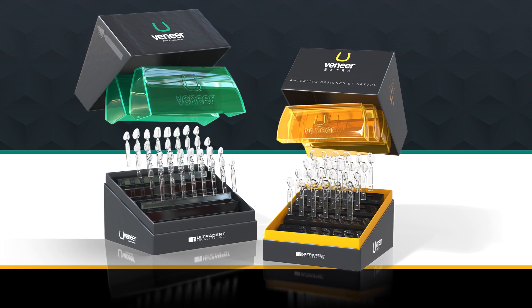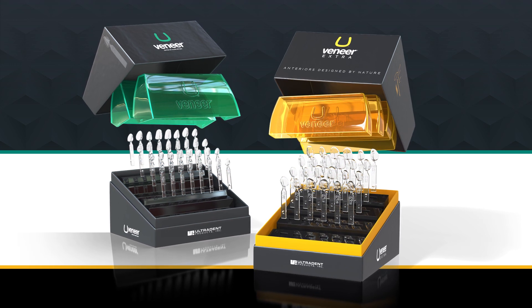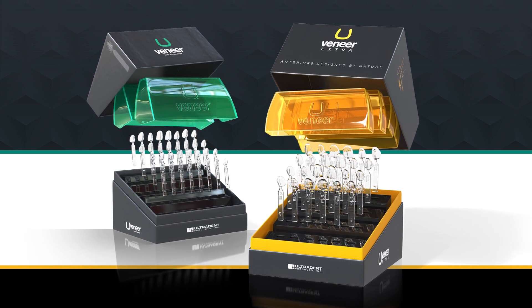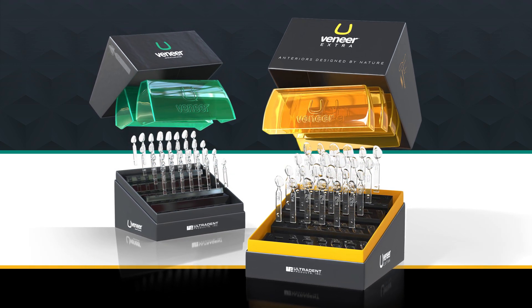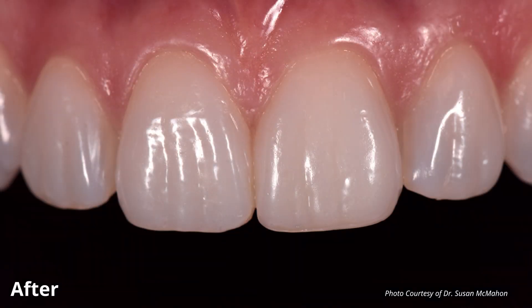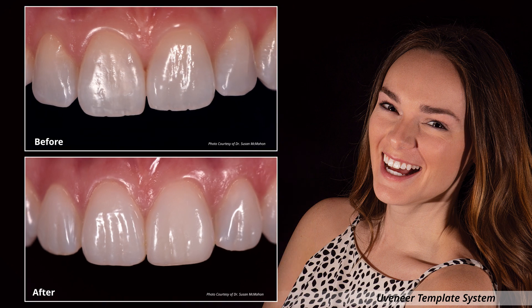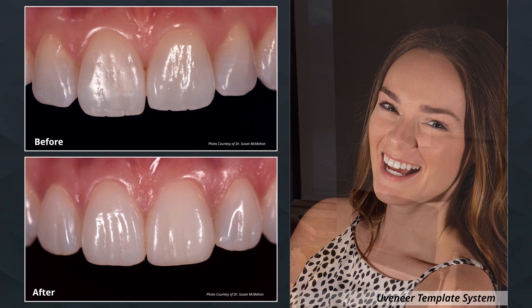The Uveneer Direct Composite Template System is designed to create high-quality, natural-looking anterior restorations and provide patients with an affordable aesthetic solution. Uveneer templates allow offices to provide an additional chair-side solution for restorations, mock-ups, shade selection, and more in a fraction of the time.